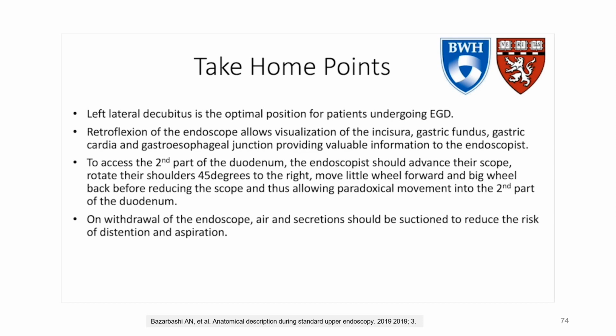Once the exam is complete, the scope can be withdrawn with gentle suctioning to decrease the risk of aspiration as the scope exits through the hypopharynx. Take-home points. Left lateral decubitus is the optimal position for patients undergoing EGD.